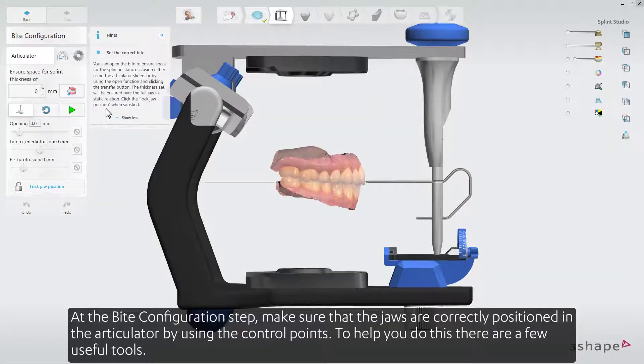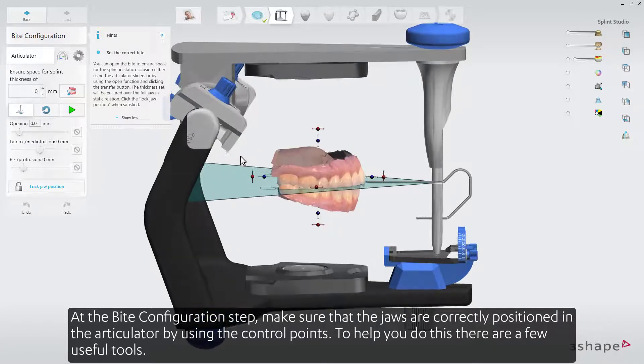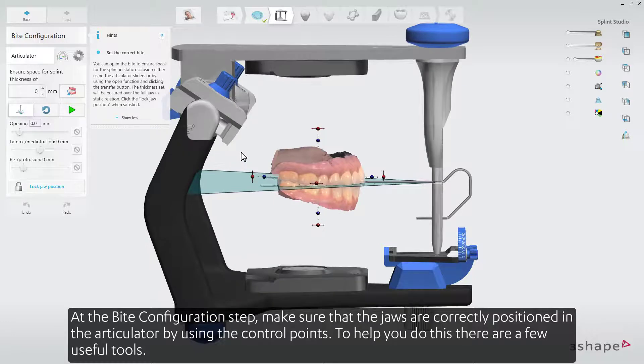At the bite configuration step, make sure that the jaws are correctly positioned in the articulator by using the control points. To help you to do this, there are a few useful tools.